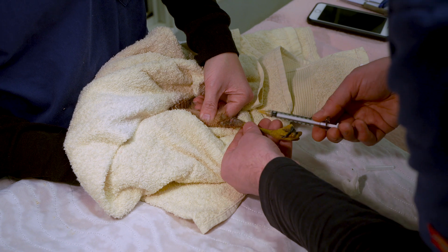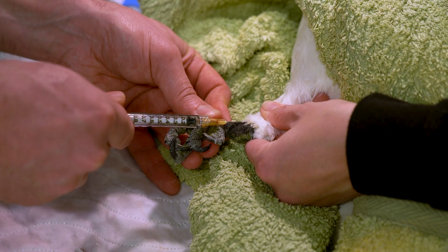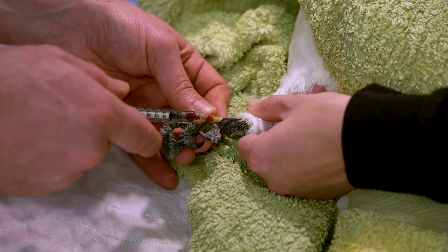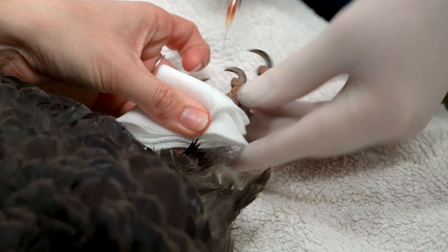There are three main vein access points you can use to collect blood. The medial tarsal vein is one of the main ones — that's on the medial area of the leg. I can use that when I want to do a PCV, total protein, a blood smear, and maybe a blood glucose. For small amounts, that's a suitable vein for most birds.